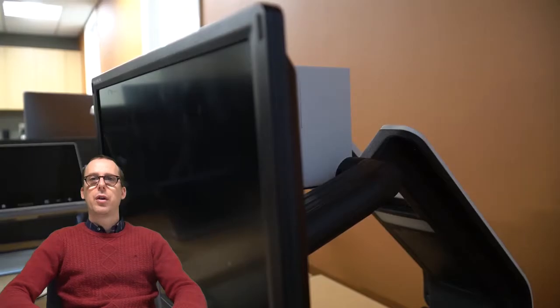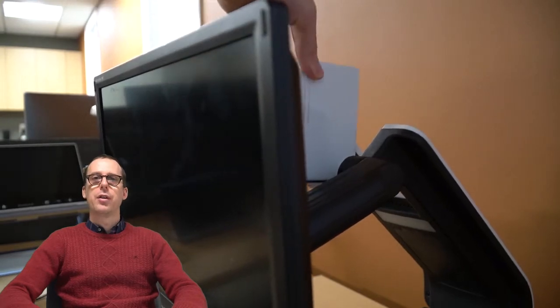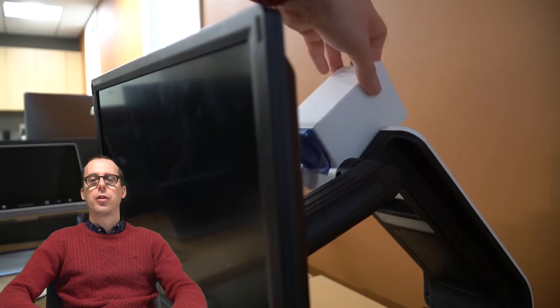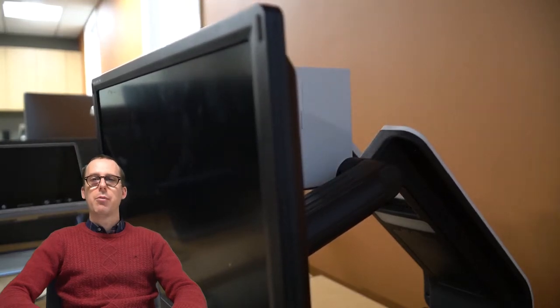The camera is located behind the screen, and it actually has an integrated lens cap, so you do have to pop that off before you can start to use the device. And the camera is interesting because you can tilt it in different ways. You can have it pointed straight down at the tray, and you can also have it pointed toward the front of the tray. So if you're doing stuff with your hands, then you don't have to put them all the way underneath. You can do them at the front of the tray and still see them. And you can also rotate that camera to look toward you for a self view, so if you wanted to do makeup and things like that.